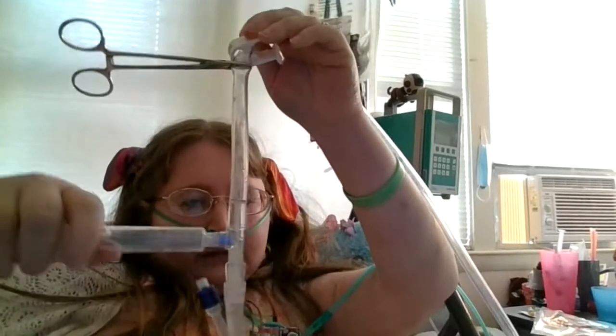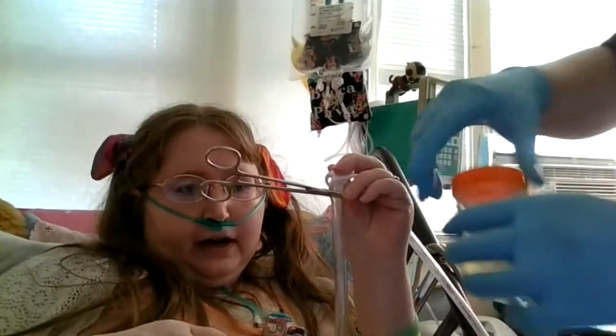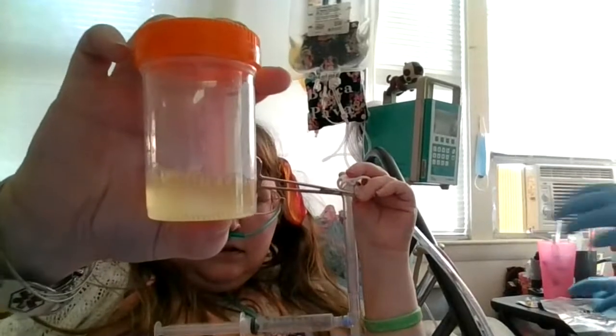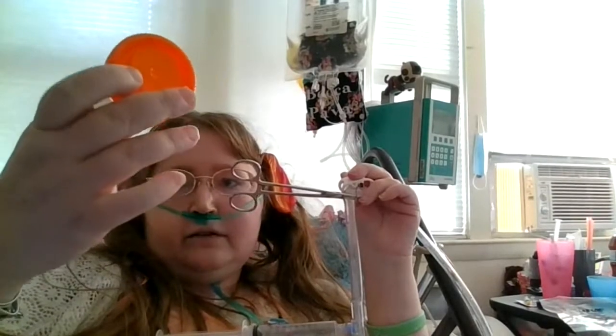My urine supply ran dry, so we're going to close up the urine cup. This is the urine cup - you can see how cloudy it is and you can sort of see all the floaties in here. It's just really cloudy.